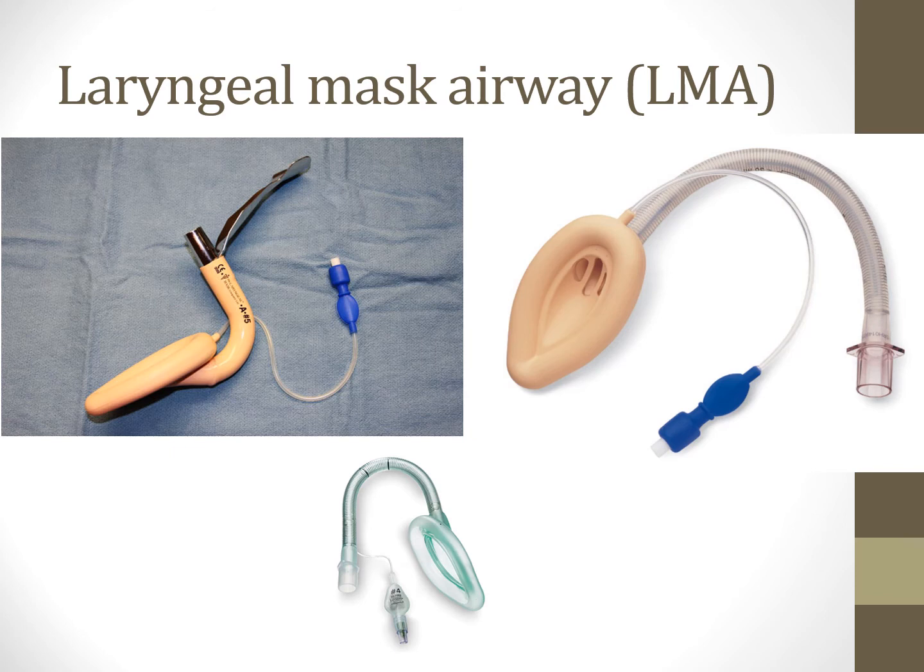LMAs, these are very common. Most commonly used for surgeries under 2 hours in the operating room. In fact, a lot of our paramedics did a rotation in the operating room to help with their intubation skills, and a lot of them did not get their intubations because they were using mostly LMAs. LMAs are great, especially something called a fast track LMA. This one here. This is an intubation LMA.